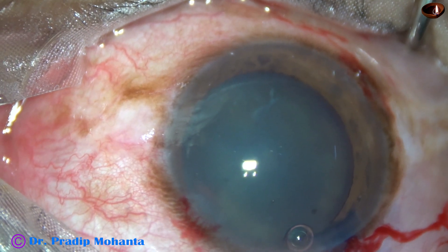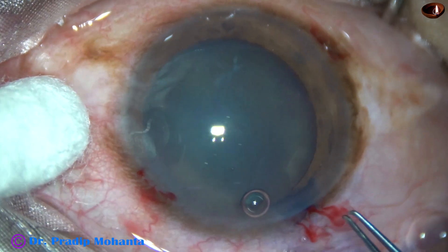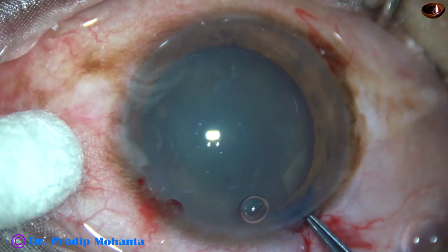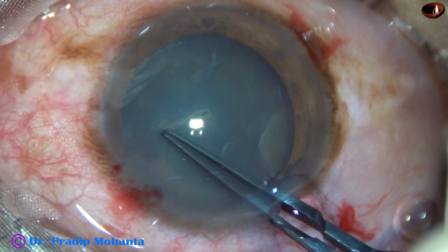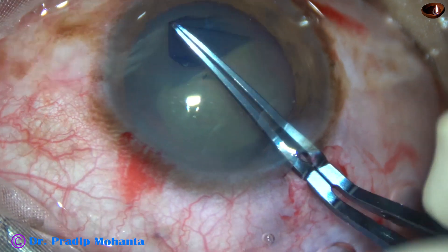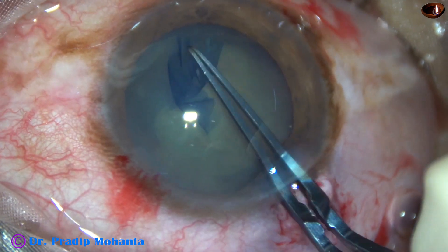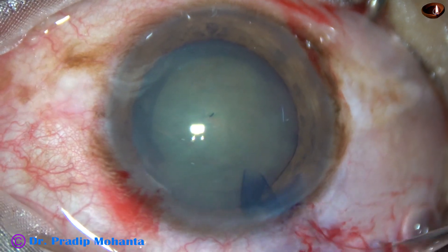Capsulorhexis is now to be done. The anterior capsule is incised by the tip of the instrument. The capsular tag is held, and a very nice approximately 5.5 mm capsulorhexis is done.